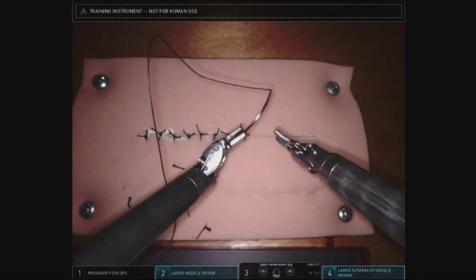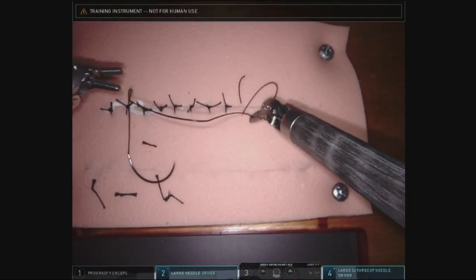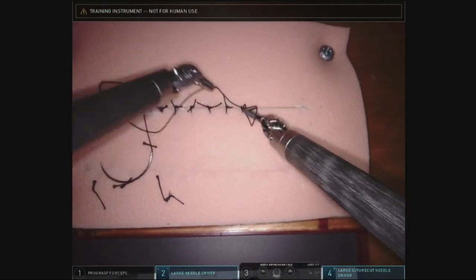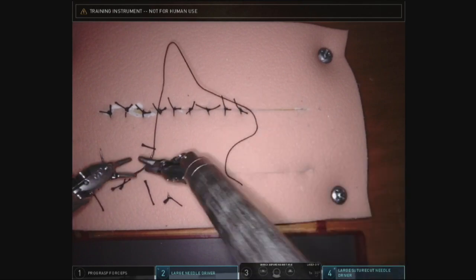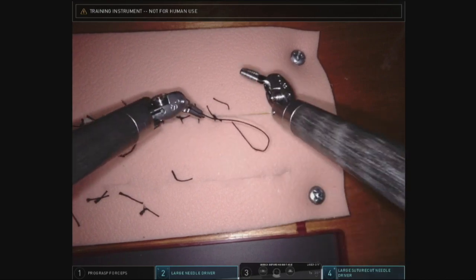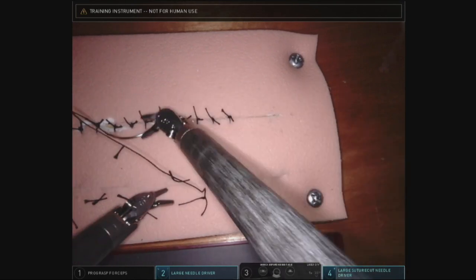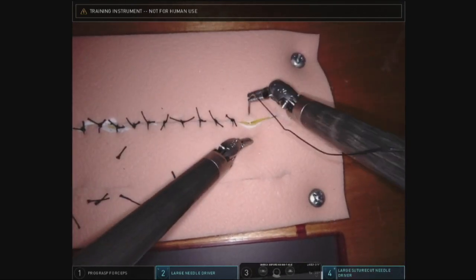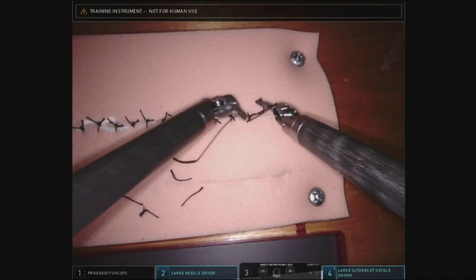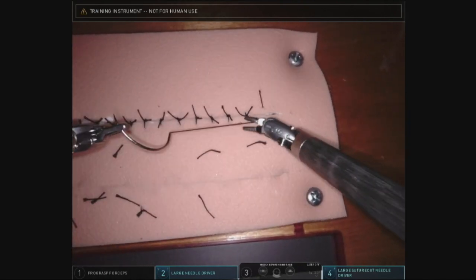Please practice good needle management by putting all the used needles in the needle box. This interrupted suturing exercise should set you up nicely for your bowel anastomosis work, which is coming up next.